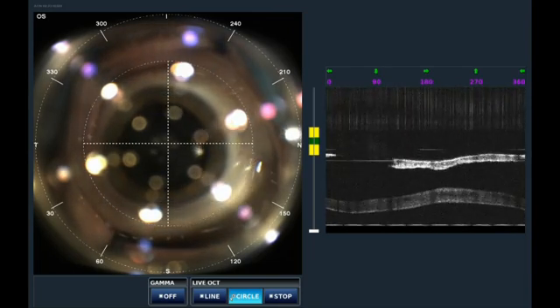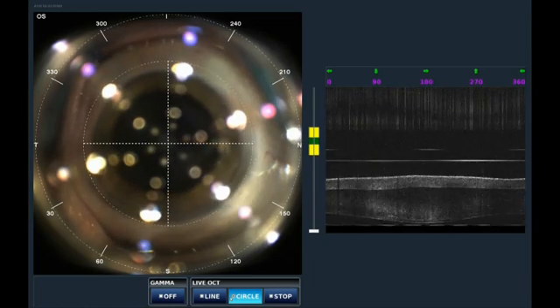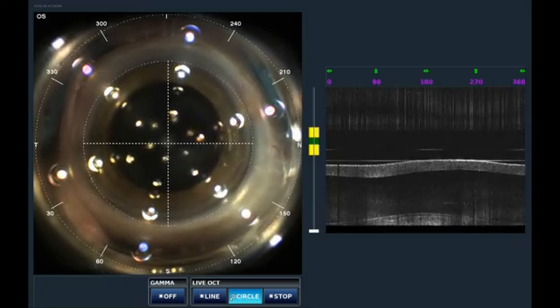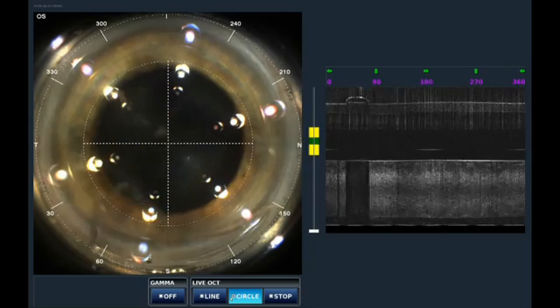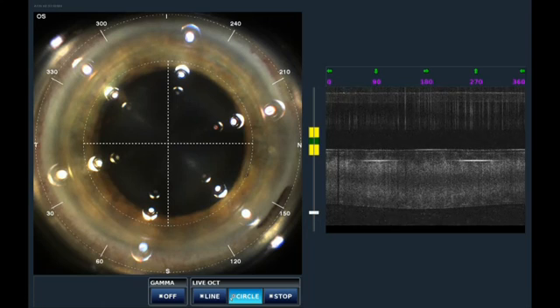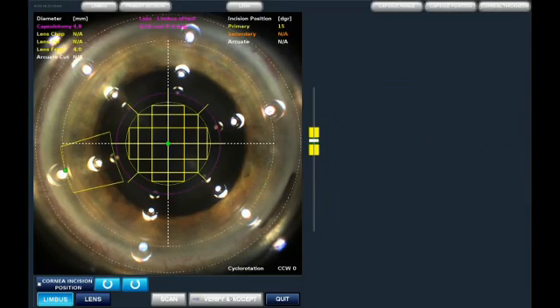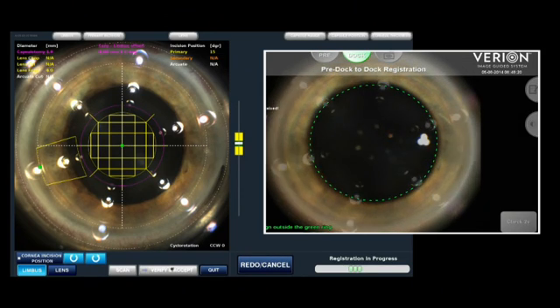Look right in the middle of those six white lights and try not to move your eye at all, even as it gets closer. We will be demonstrating the use of the Verion — suction, you'll feel a little bit of pressure. The first thing you will notice is that we have not had to mark the eye in the preoperative area at the six o'clock position. This is a tremendous advantage with the Verion.